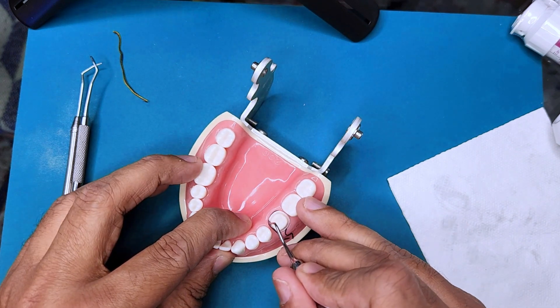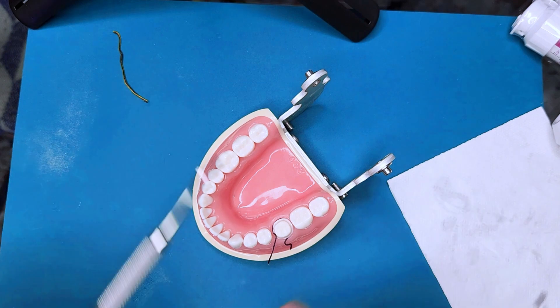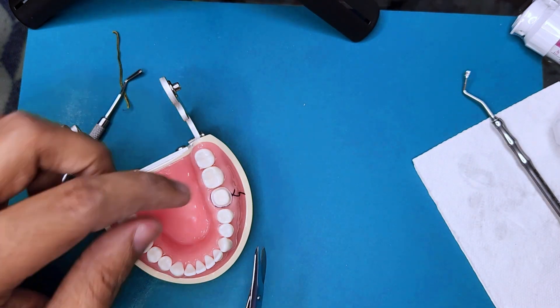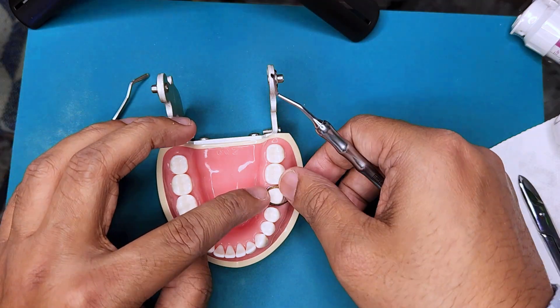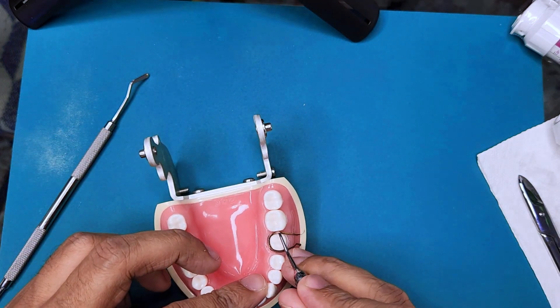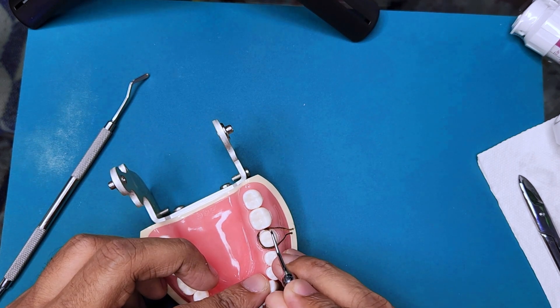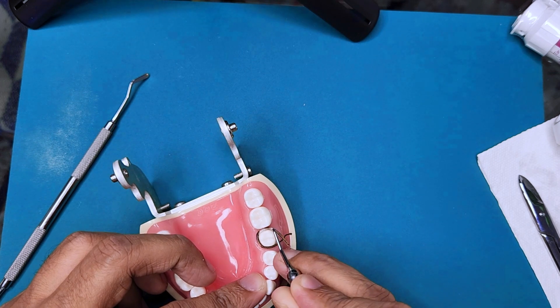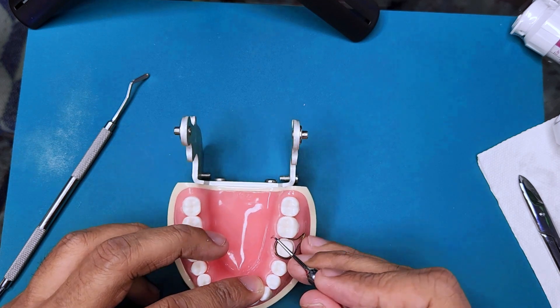The first cord placed is the triple zero cord — its function is to provide vertical displacement of the tissue, not so much retraction. The second cord placed on top is the thicker cord, double zero or zero depending on the tissue, and its function is to give horizontal retraction of more than 0.2 millimeters. These two cords act vertically and outward.